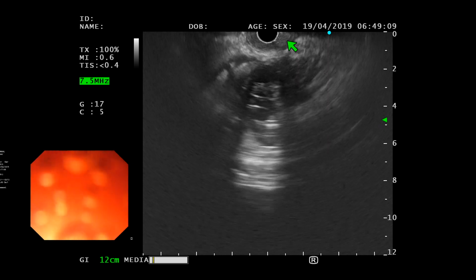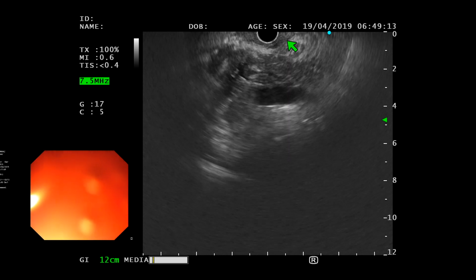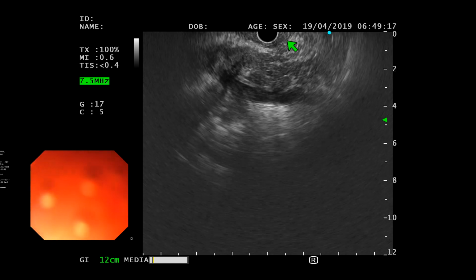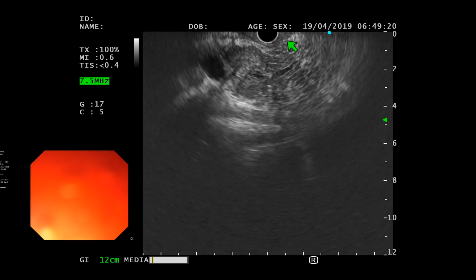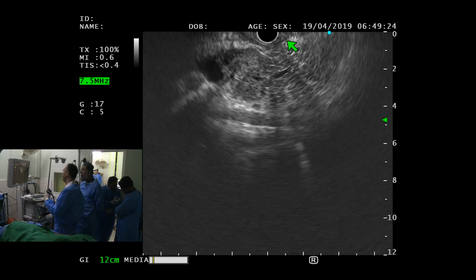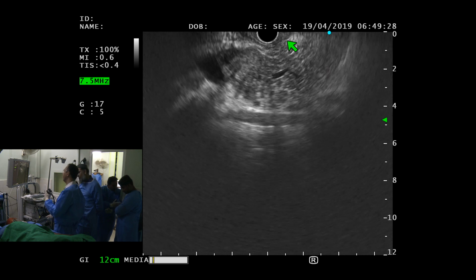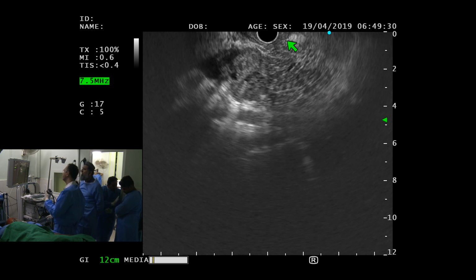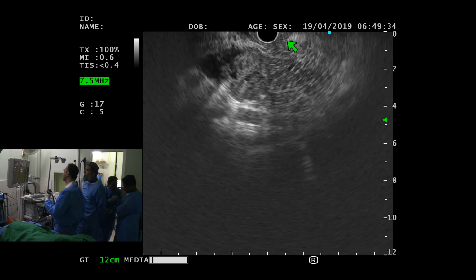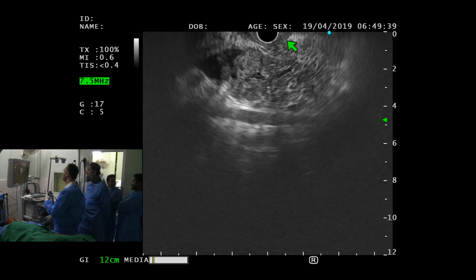Is your plan to do an FNA? I'm not sure, because I see multiple lymph nodes present and a clear-cut abnormality. What benefit are we going to give to the patient? Okay, two questions. The patient is only 55. Okay. So, firstly, if this is adenocarcinoma, I don't know a lot of oncologists. I am a pessimist, so let me start by saying that.